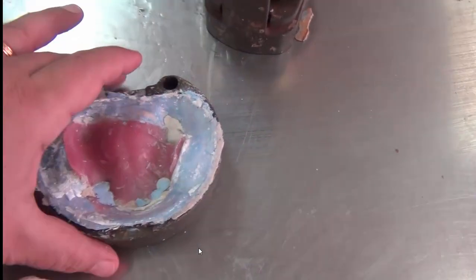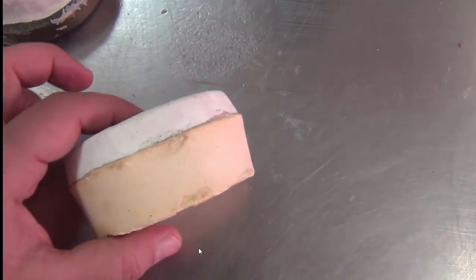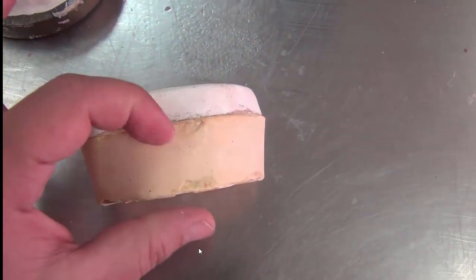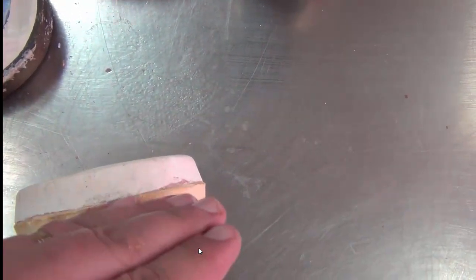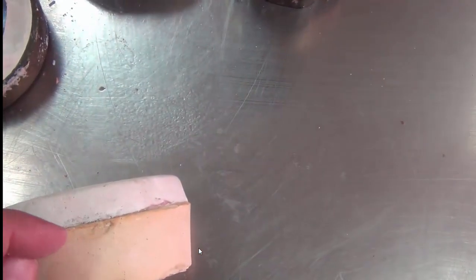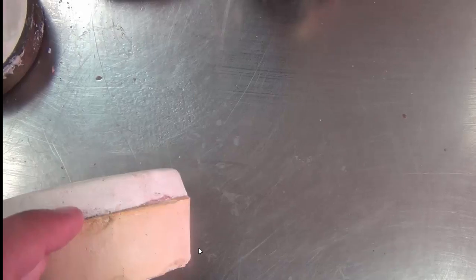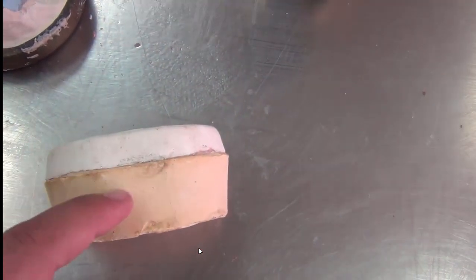Some other times we might get this situation where the flask separates. You had good Vaseline on the flask, so the flask totally separated, but the junction in between is still not separated. Here we need to wedge in between these two layers using the plaster knife and hammer in a controlled manner, trying to concentrate our forces on the plaster, not the stone, because this will fracture off the cast, and we can see the separation between the layers easier because this is softer than this one.